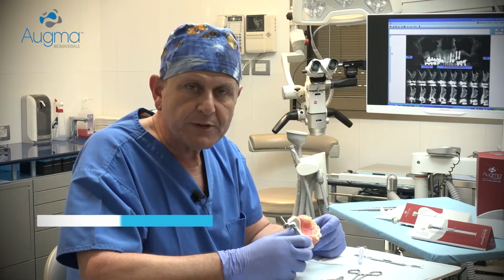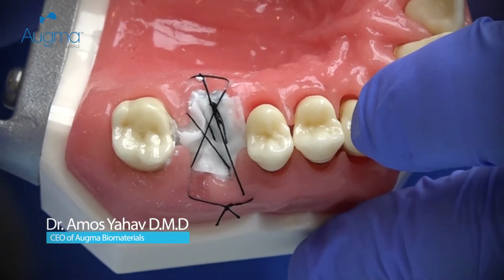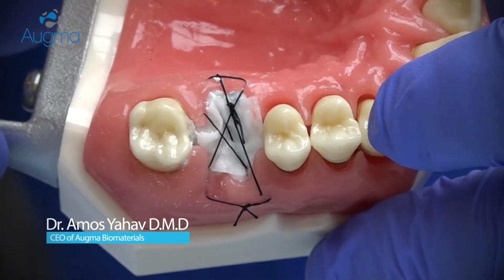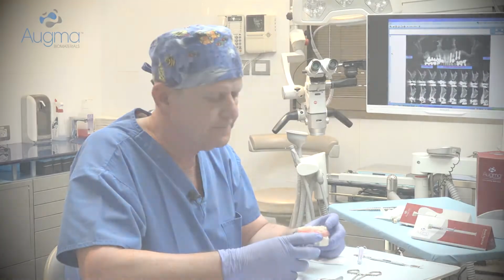Now the graft is protected and you can leave it exposed in that way. Soft tissue will migrate above the graft and will close the area. That's all.